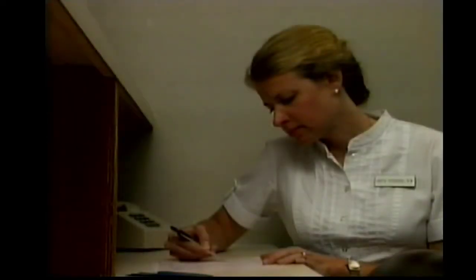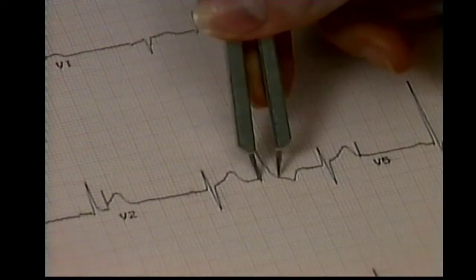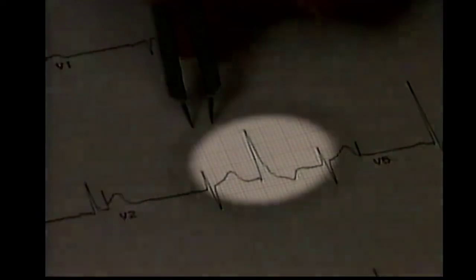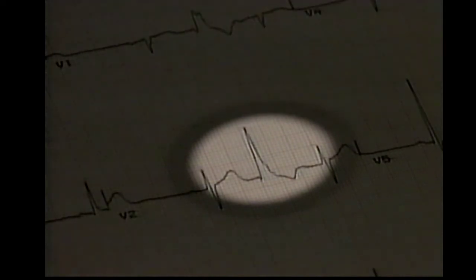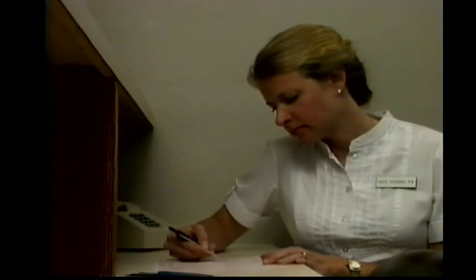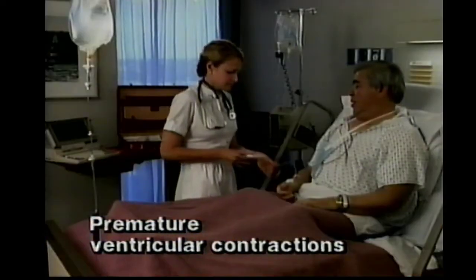As the nurse examines his 12-lead EKG, she notes that some waveforms do not have a P wave. The duration of some QRS complexes is greater than 0.12 second. These widened complexes are not preceded by a P wave, are early, and they have a bizarre appearance when compared to the normal sinus beats. The deflection of the QRS complex is opposite that of the normal sinus beats. The bizarre widened complexes are premature ventricular contractions, or PVCs.